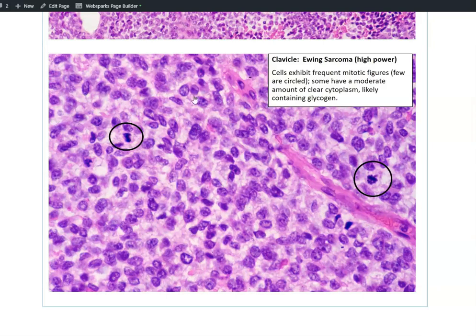For example, in this high magnification field, we can already see one, two, three mitotic figures. So we know that this tumor is very actively proliferating.